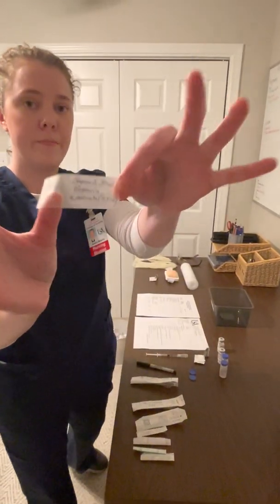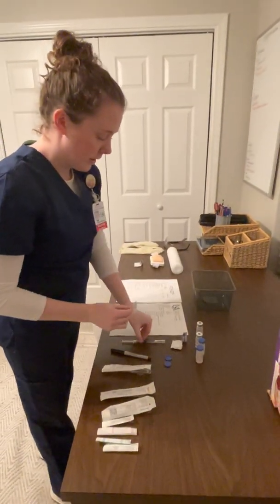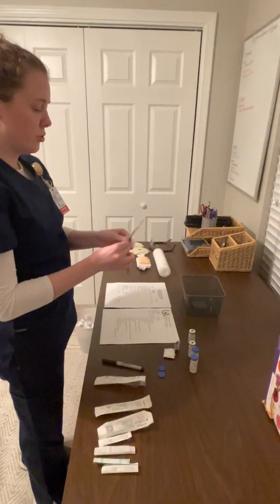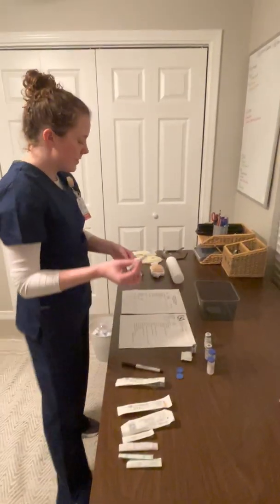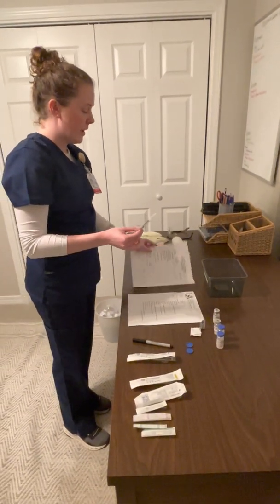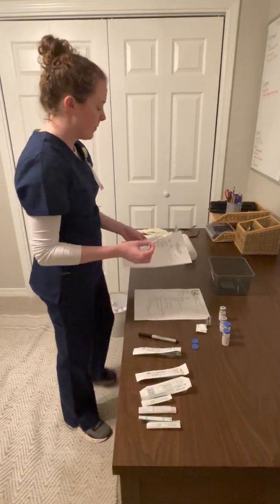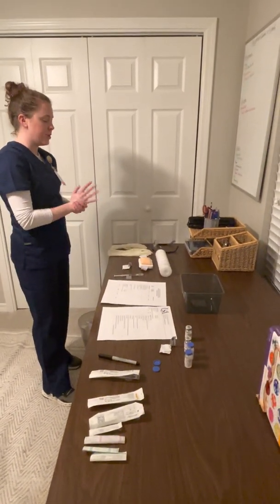And here's my label. I'll then put my label onto my syringe. Now that I have this syringe that's labeled, I will then get my MAR and I can proceed into my patient's room. So once I get into my patient's room, I will immediately perform hand hygiene.